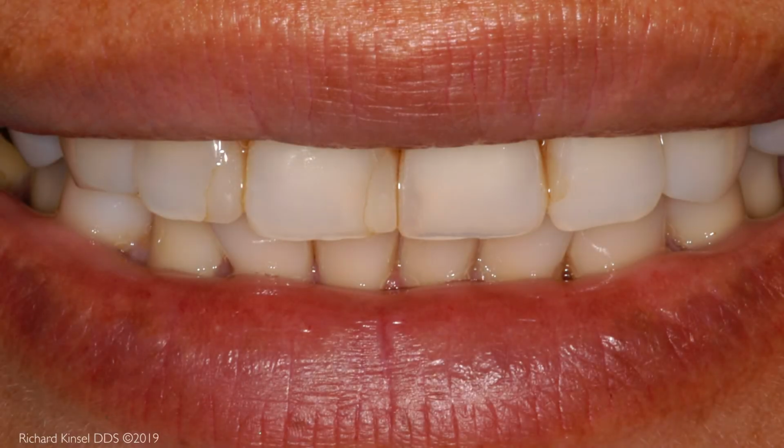This patient requires 4 porcelain crowns due to the lack of healthy tooth structure. All the remaining teeth will have in-office bleaching prior to choosing the final color of the crowns.